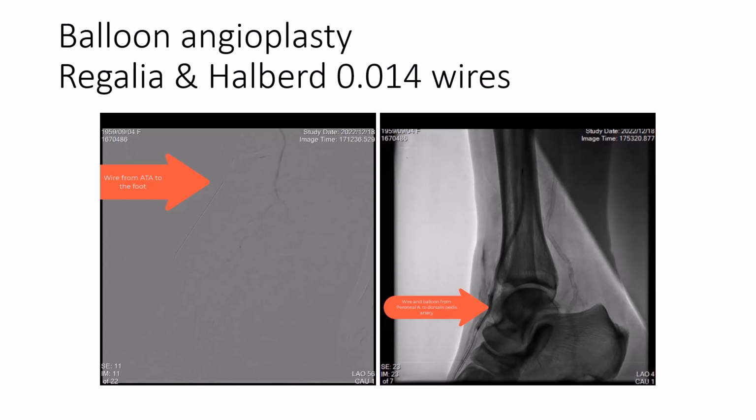Careful review of the images revealed probable continuation of the peroneal artery to the dorsalis pedis artery as a type 3b anatomic variation. Wiring was made along the peroneal artery tract to the occluded segment into the dorsalis pedis artery, followed by balloon dilation. The total occlusion lesion was completely recanalized without dissection and residual stenosis. Final angiography showed an excellent result indicating a type 3b variant.